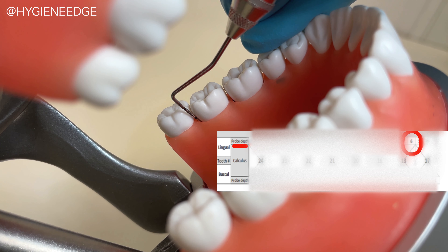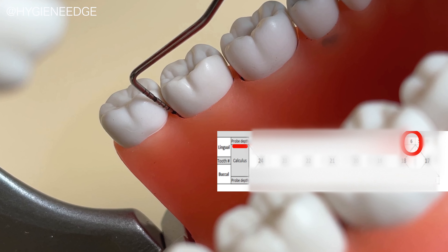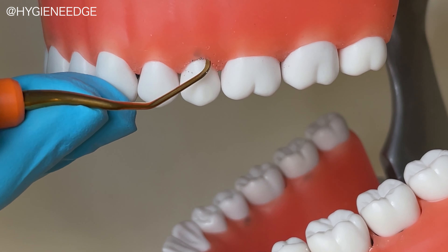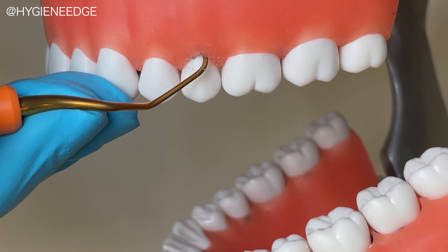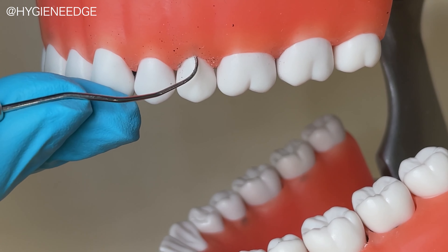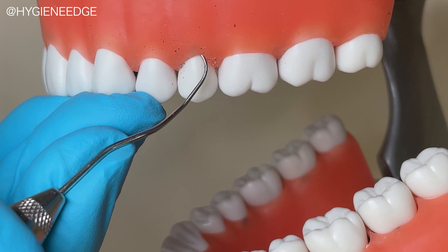For example, on number 18 distal, the depth should be six millimeters, so I can test to see if I'm within one millimeter of accuracy. When it comes to instrumentation and perio pockets, can a typodont really help calibrate and refine scales? Well, the answer is yes. When typodonts have a variety of pockets, calculus, and bone levels, clinicians can assess what's working and what isn't when it comes to calculus removal.